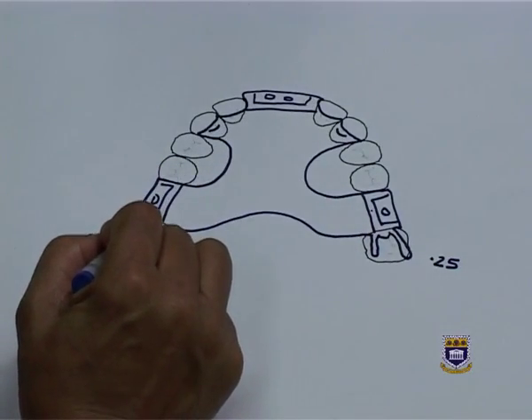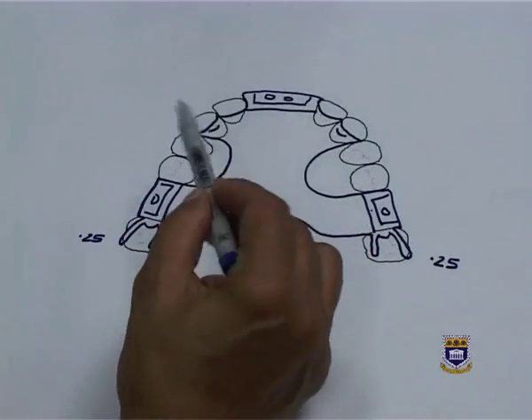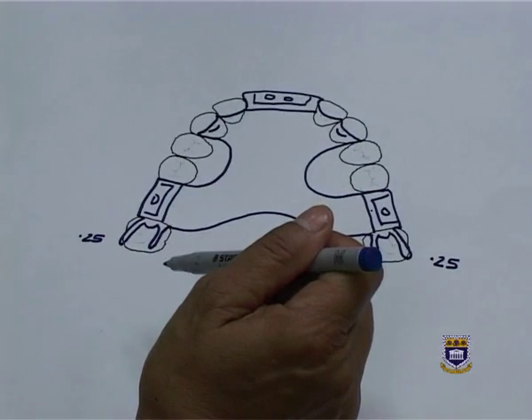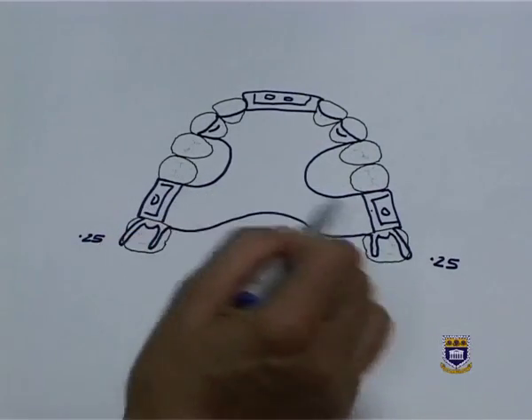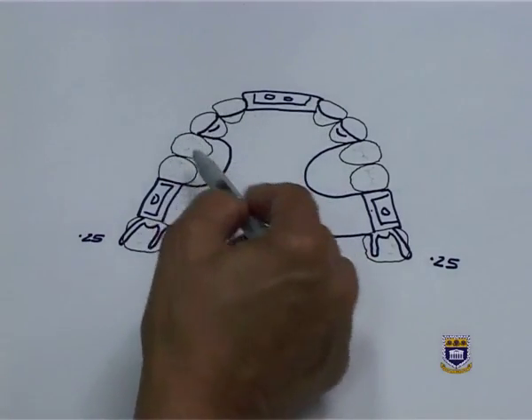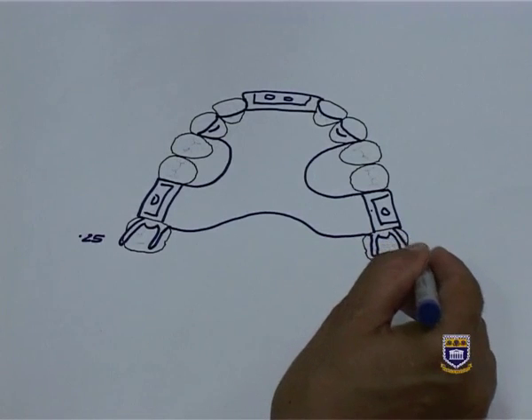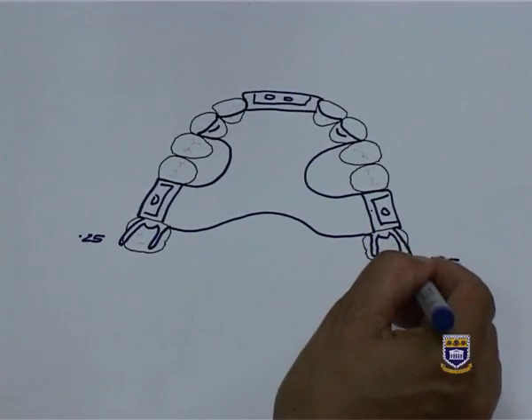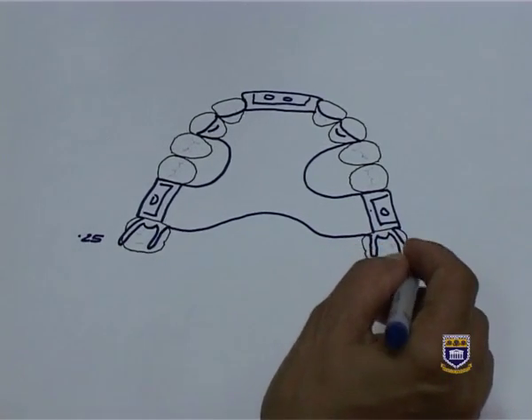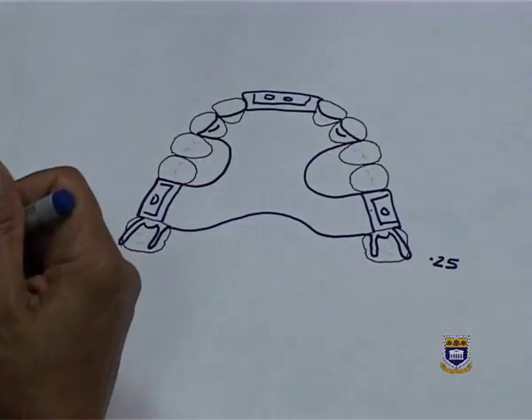I've got 2 mesial rests on my molars, so that will satisfy the principle of having at least 3 rests. I've got my 2 clasps, 1 in each quadrant. I have connected all my components. I have provided, or in the clinic I will build up to provide, a 0.25 undercut if I did not have adequate undercut, and this will be my metal partial denture.